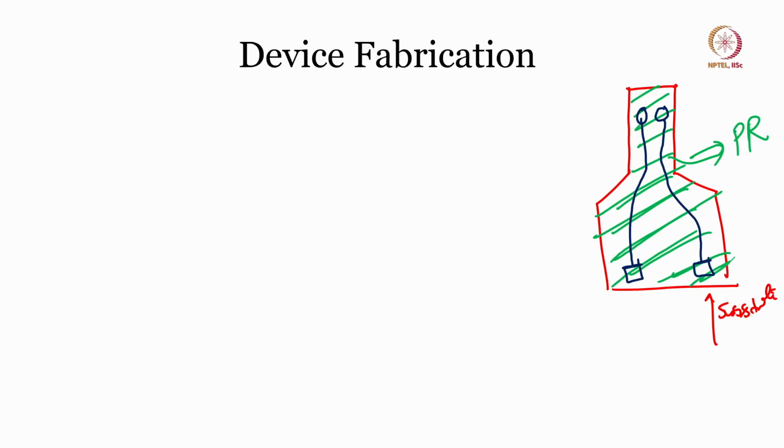There is a developer, photoresist developer. What you do is you need to remove it, but just like that you cannot remove it, there is a process. You should do something called lithography, this is what I am referring to. Now, photoresist is removed at these areas wherever the black regions are there, in that area photoresist is somehow removed.